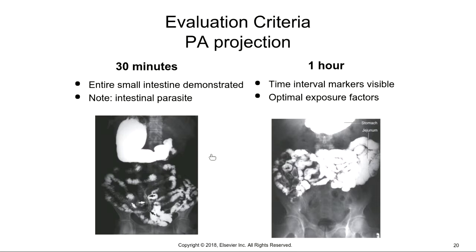All right, and then at the 1 hour, they want to make sure that you recognize time markers have to be visible on there, and you want optimal exposure factors. I don't see any time markers, but again, this could be annotated with all of our digital equipment.